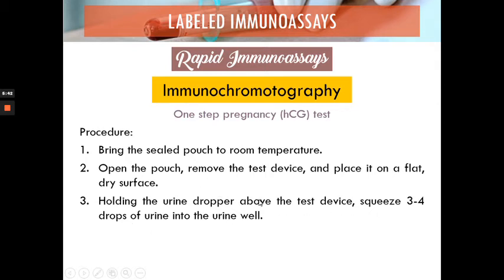Again, what is the most prescribed specimen to detect pregnancy? Do you still remember? I hope so. My previous students would have pressed the buzzer already. What is the prescribed specimen for testing to avoid a false negative? Pregnancy test results, your first morning urine specimen. Why? Because your first morning urine specimen is considered to be the most concentrated, since it's the urine that accumulated overnight.